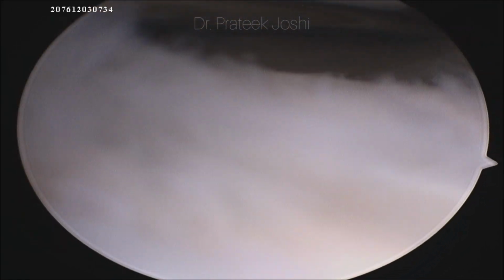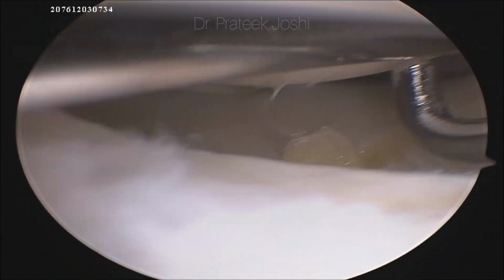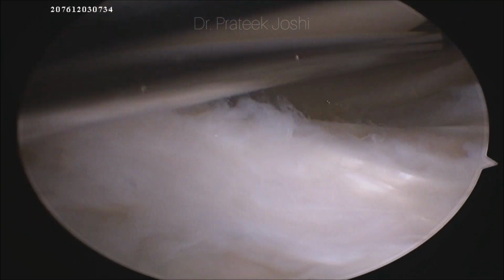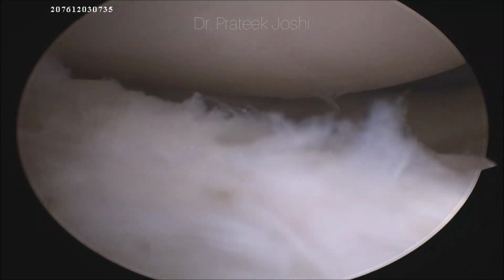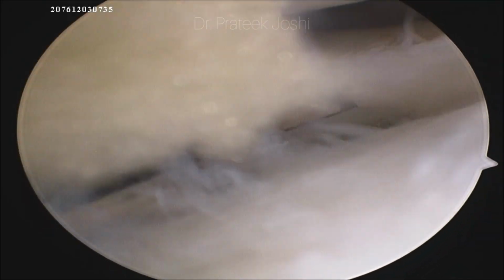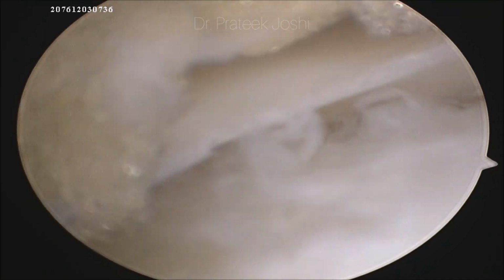Now I am going to take another final outside in suture through the anterior portion of the lateral meniscus. Here I am taking a simple stitch, which you can make out that I have pierced the capsule but I haven't pierced the meniscus tissue. So I am at the superior end of the meniscus. So the first stitch is passed superior to the lateral meniscus, and now I am passing the second suture through the substance of the meniscus. So this will be simple configuration of the suture which we are going to pass through the anterior horn of the lateral meniscus.